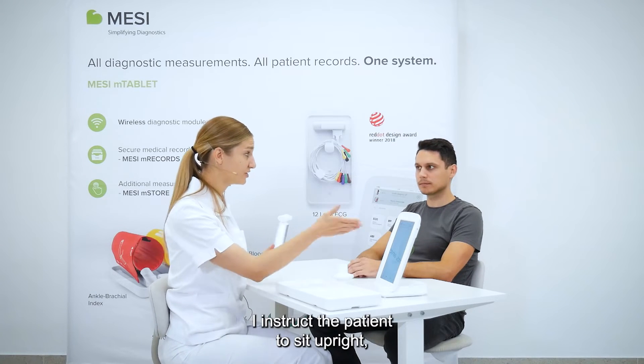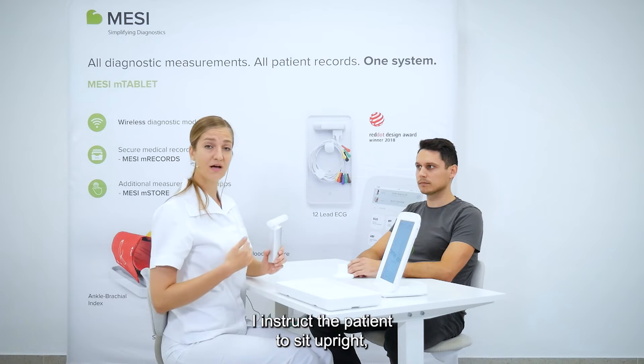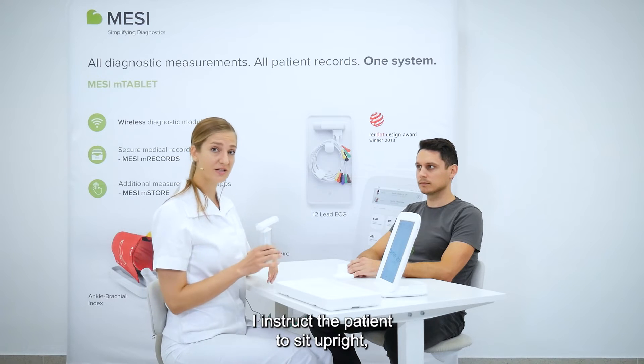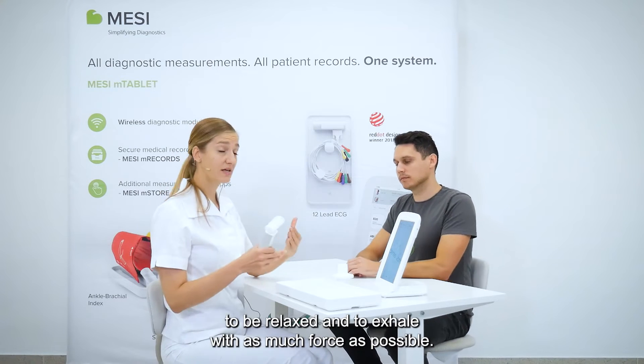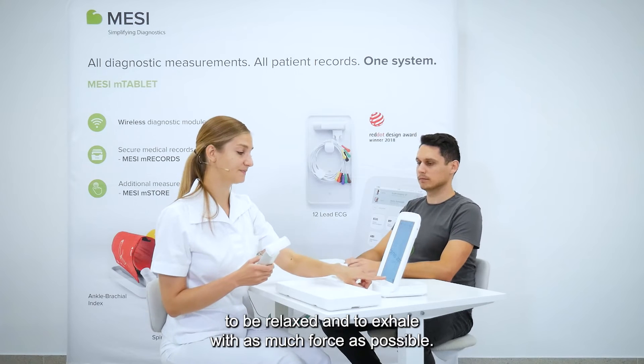I have to instruct the patient to sit in an upright position, to be relaxed, and to exhale with as much force as possible.